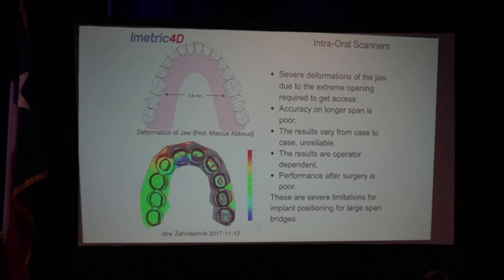But now you're relying on the software to stitch that together. So when I say that all of my arches fit and I scanned it, it's because I gave the scanner good information. I'm understanding the stitching process. So the first scan pass, if it stops, I stop, delete, and do it again, because I want the first pass to be good because it's putting all that information together based on that. And if I stopped, and I know that it's going to have to guess, I don't want any guessing. Hopefully you guys understand it better, because trust me, I see so many people post videos online and I'm seeing the scan path and I'm like, okay, you may or may not fit. The idea is to be predictable, and that's what this is showing.